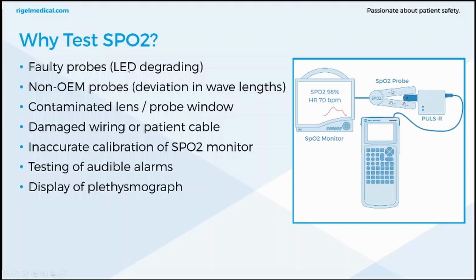So why test SpO2? Faulty probes, LEDs degrade over time. You might have non-OEM probes, so there'll be a deviation in wavelengths. Sometimes there's crossover between the connections of the SpO2 probes, so it can be easy to get some crossover again between the probes that are used. There's contaminated lenses or probe windows, damaged wiring or patient cables, inaccurate calibration of the SpO2 monitor itself, testing of the audible alarms, display of plethysmograph.